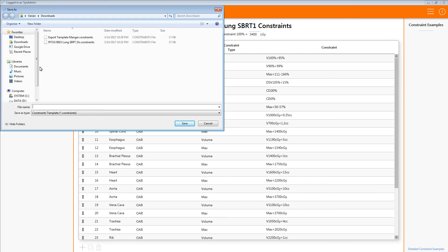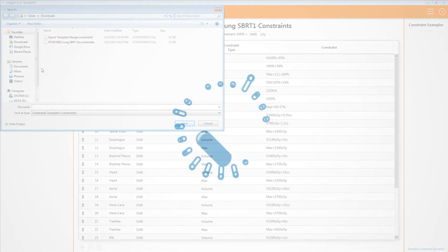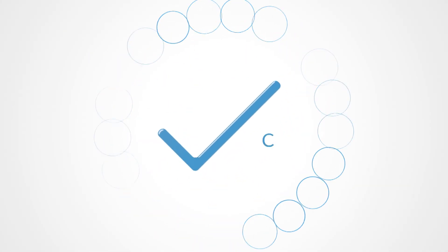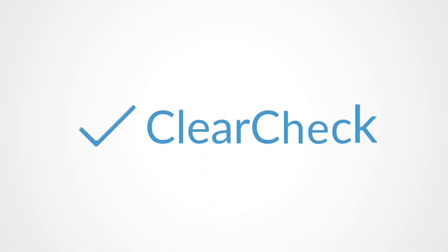This concludes importing and exporting constraint templates. ClearCheck — Efficiency through simplicity.